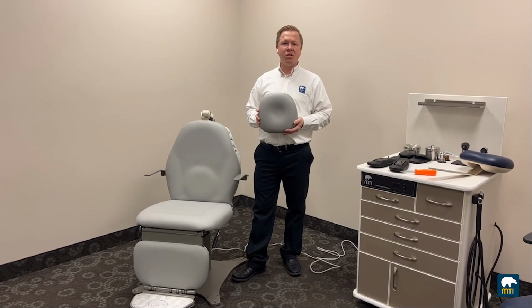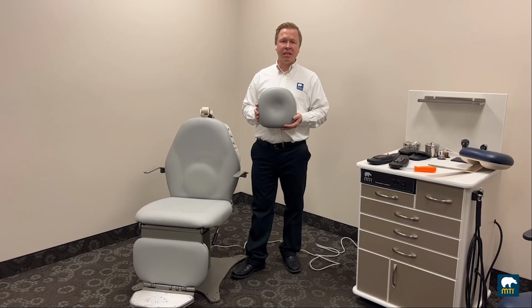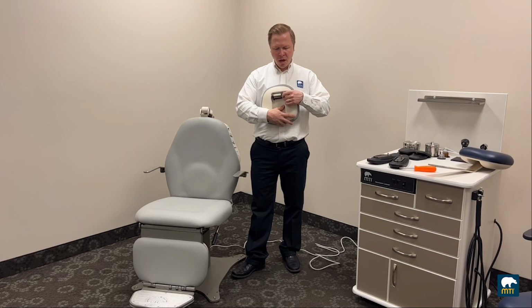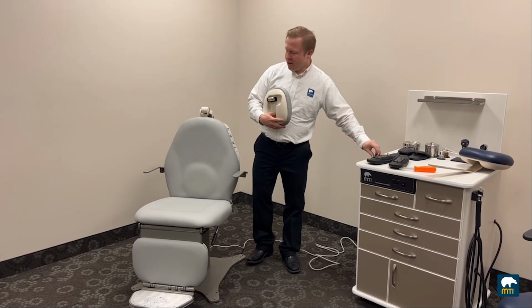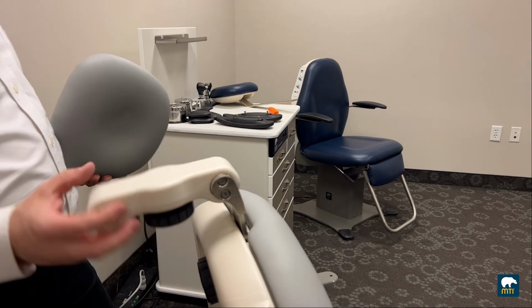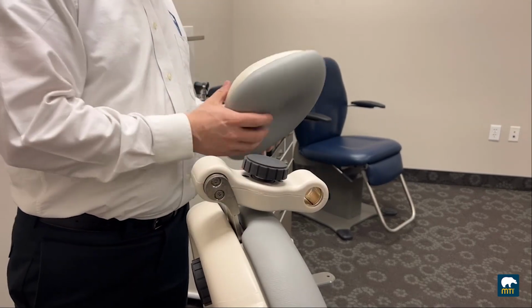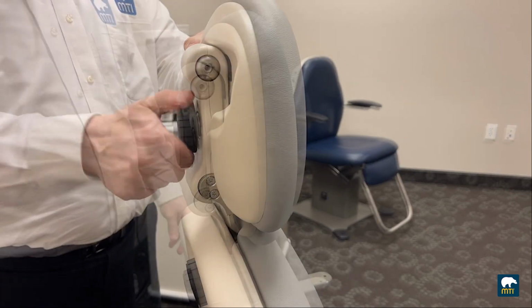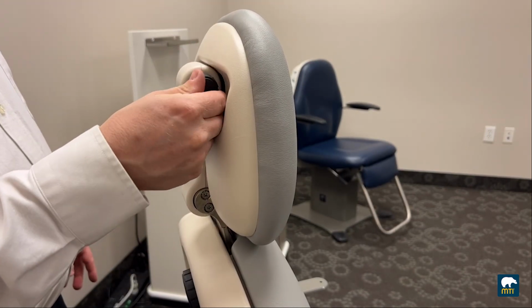If your 461 chair did not come with the upholstery installed, the next step is to install the headrest cushion. To do so, remove the knob on the back of the cushion, unlock the headrest lock, making sure that it's completely unlocked, flip to the front, and install the headrest cushion into the lock mechanism. Next, replace the knob on the headrest cushion.